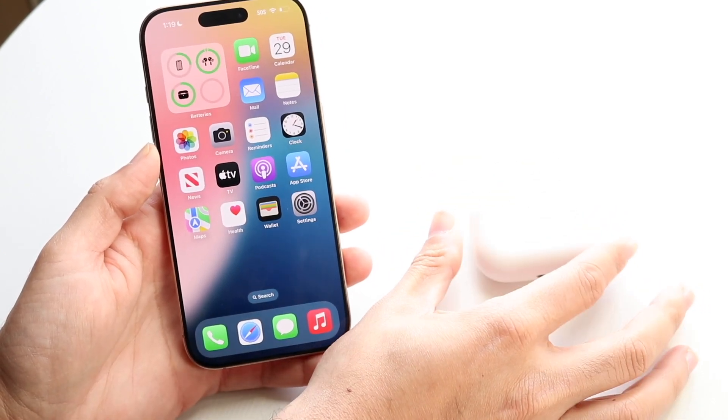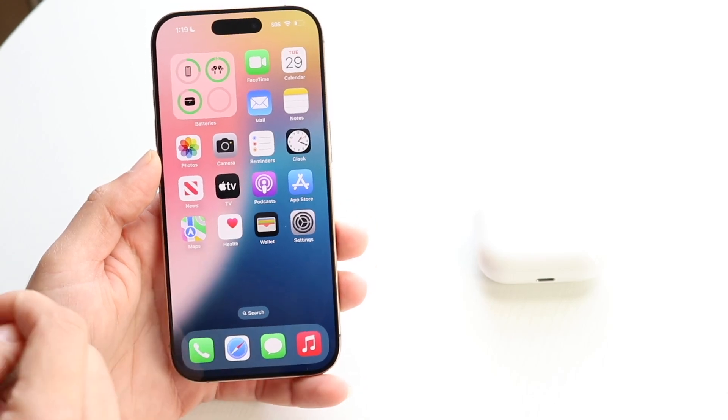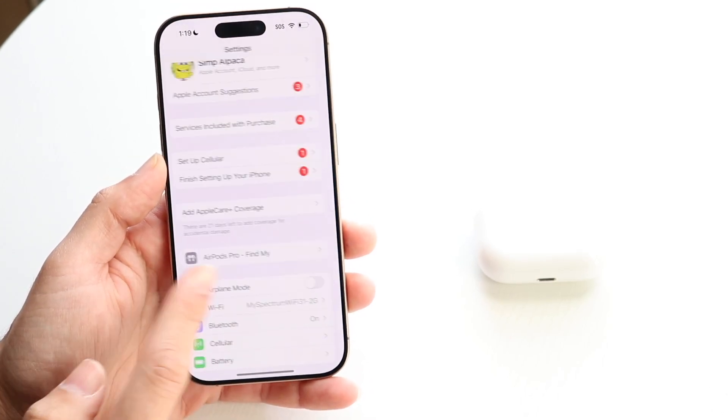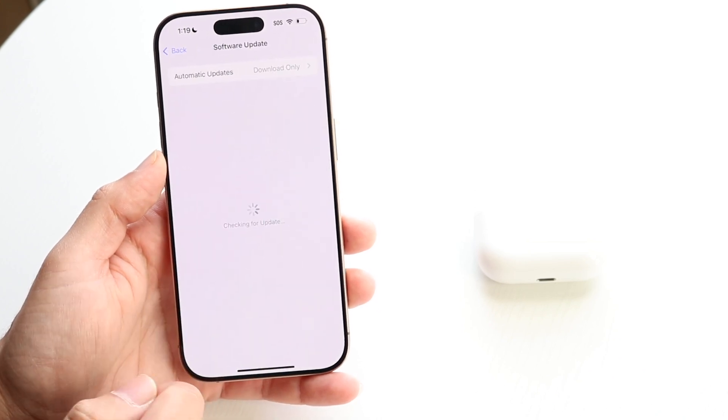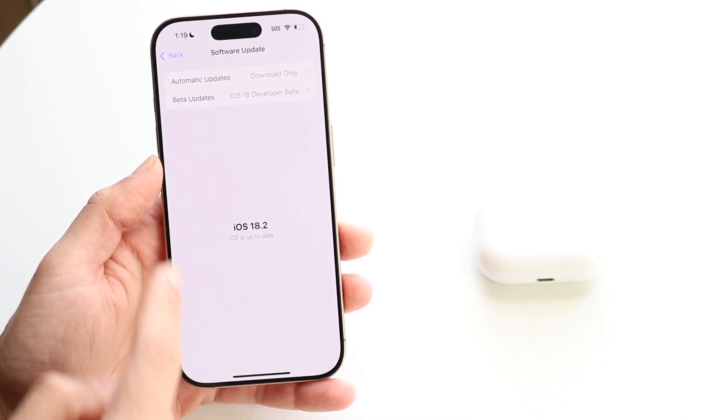If there are newer ones in the future, just make sure you have those. You also have to be on iOS 18.1 or above. You can check that by going to the Settings app, tapping General, then Software Update, and making sure you're on iOS 18.1 or above.